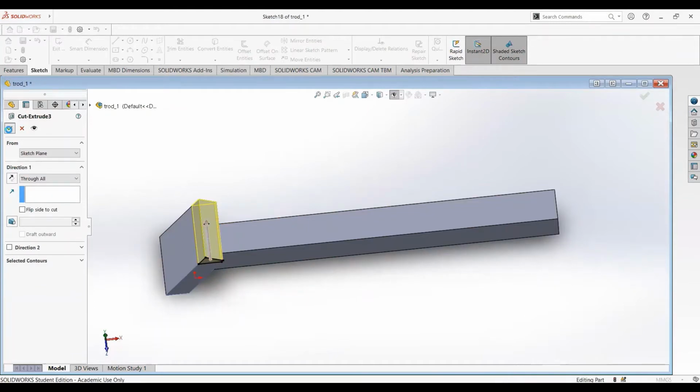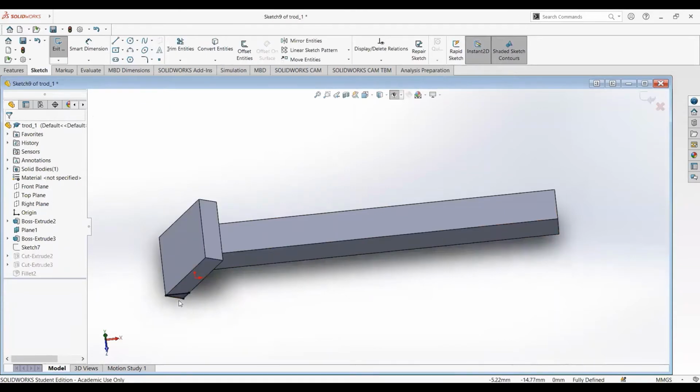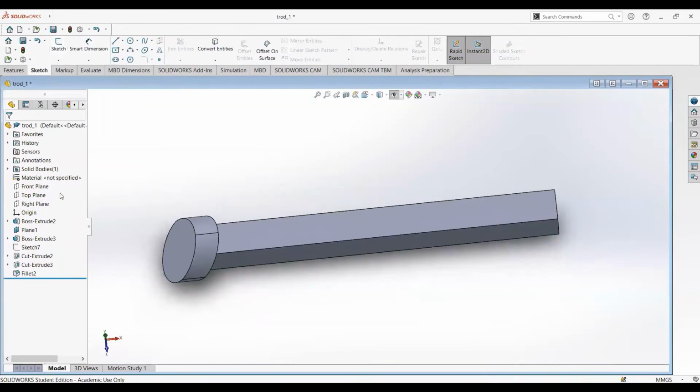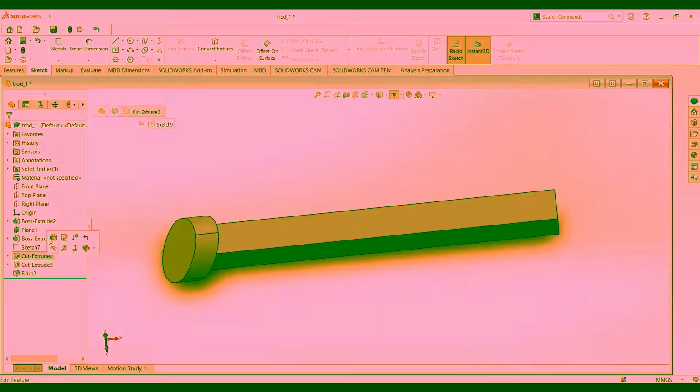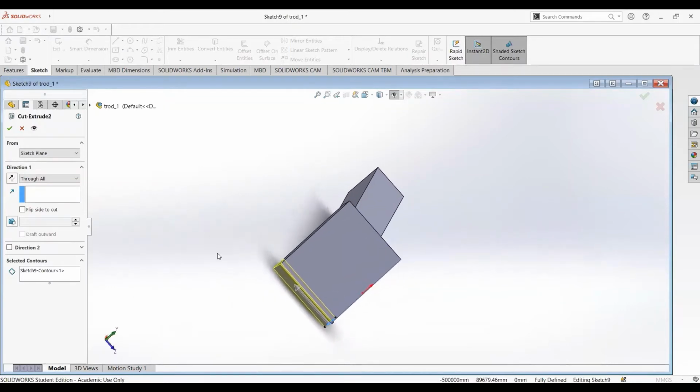We did the exact same thing to the other side. We connected with all the lines. And then we extruded this as well. And then we put through all, of course, because we wanted to cut extrude all the way.